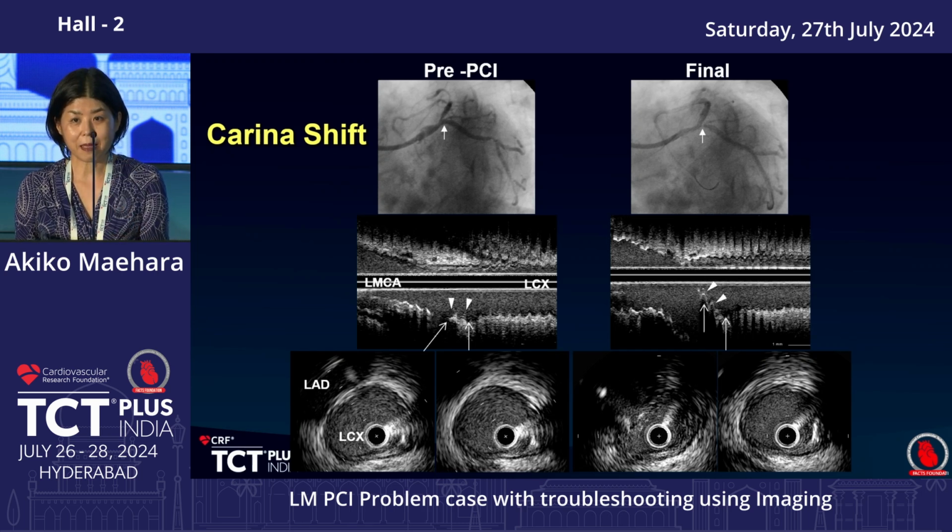But when this happens, it is typically if the circumflex is quite normal. So considering this pattern, we thought that circumflex is okay, because it is almost like a natural stent based on the calcium.